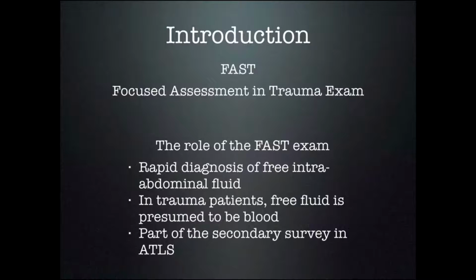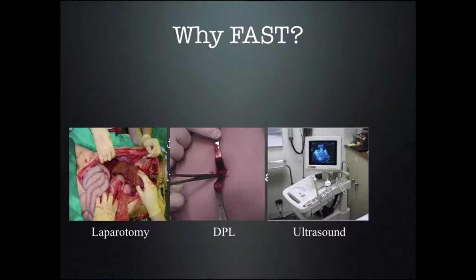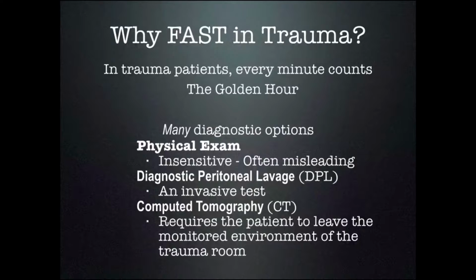Clinicians who use ultrasound in their daily practice can use the FAST exam not only for trauma, but for many other indications. However, we will focus on the trauma applications in this lecture. So why do we want to use the FAST when we have many diagnostic modalities in the trauma patient? Well, in the trauma patient, every minute counts. This is why we call the first hour the golden hour. If we can make diagnoses quickly, we can have an impact on morbidity and mortality after trauma.